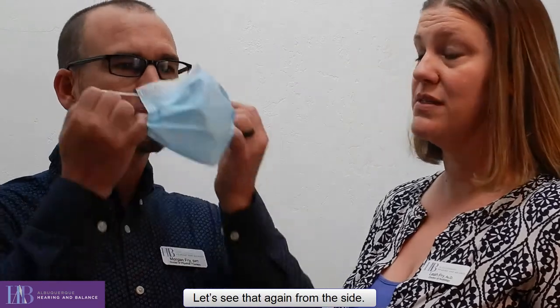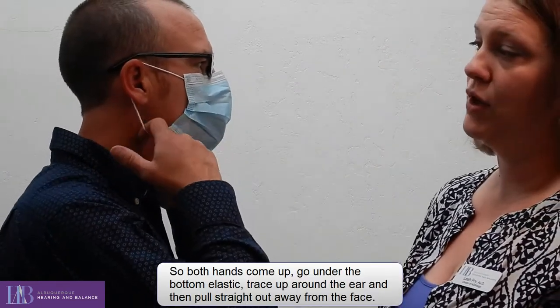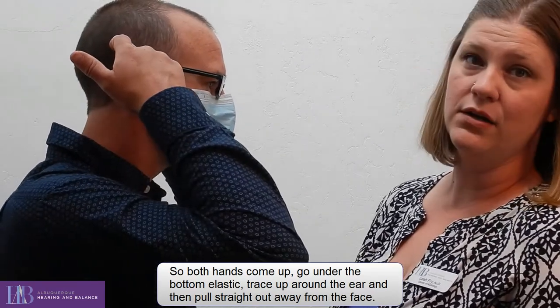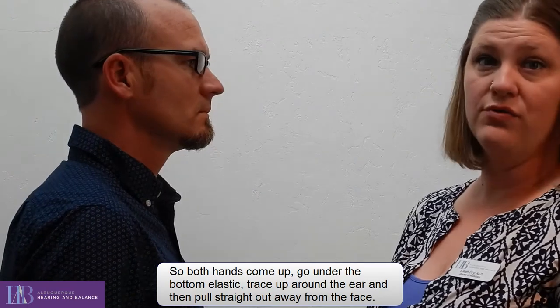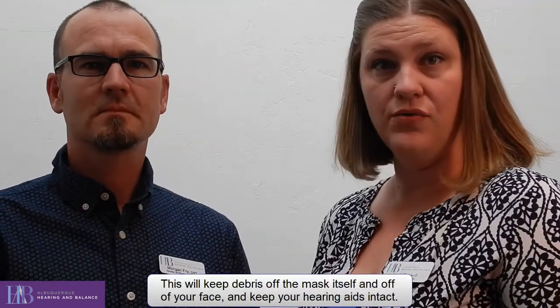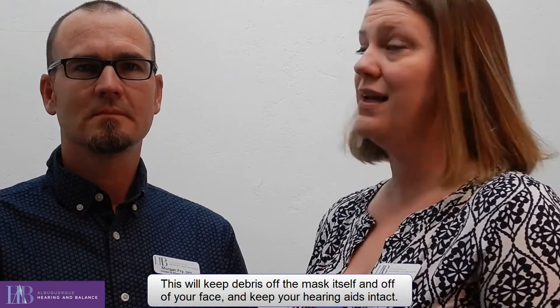Let's see that again from the side. So both hands come up, go under the bottom elastic, trace up around the ear, and then pull straight out away from the face. This will keep debris off of the mask itself and off of your face, and keep your hearing aids intact. Thank you.